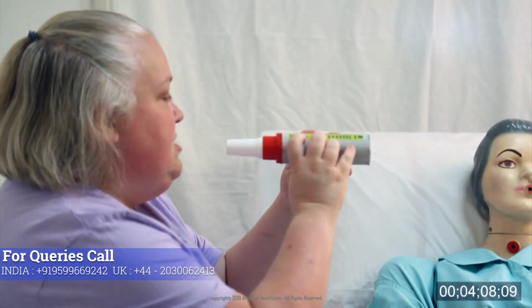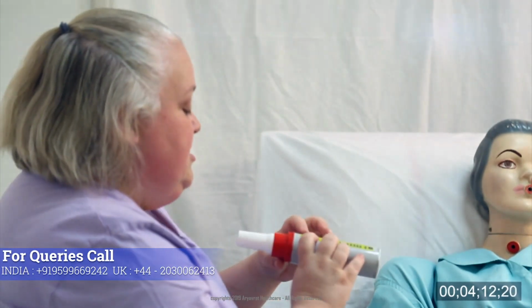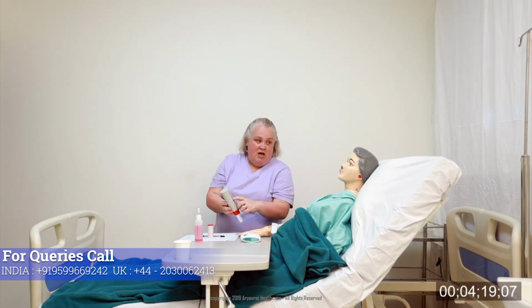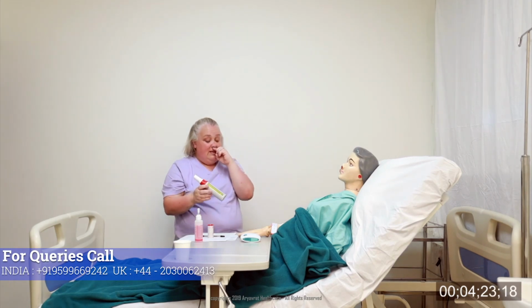Right angles, horizontally, sharp breath in, and as deep and as hard as you can. That will make this slider slide up, and we're going to record what the measurement is. We need you to do that 3 times, Helen, okay?